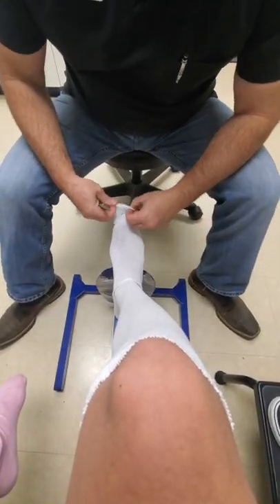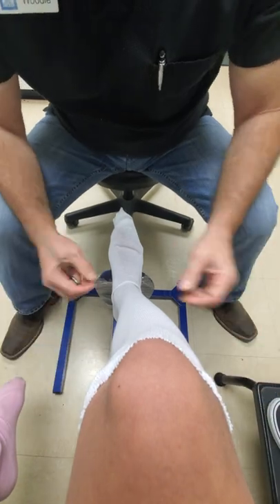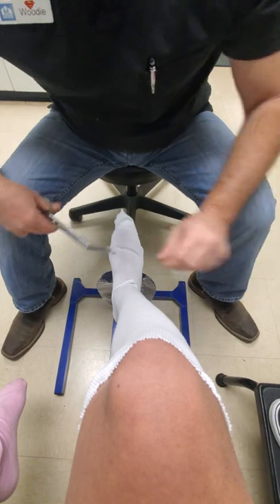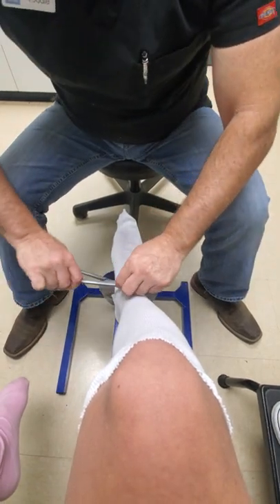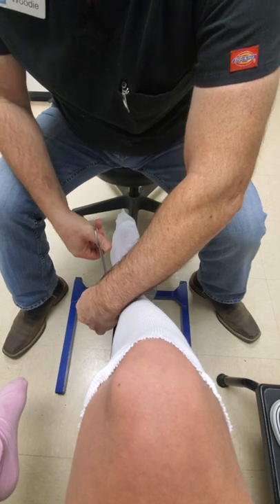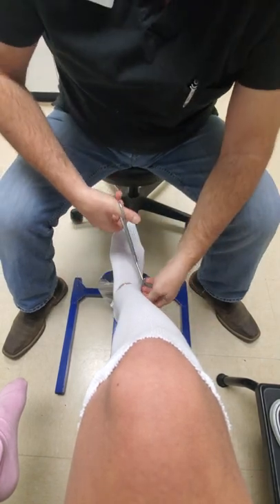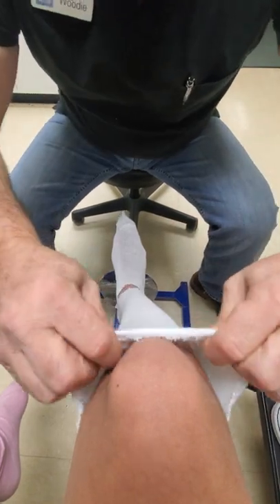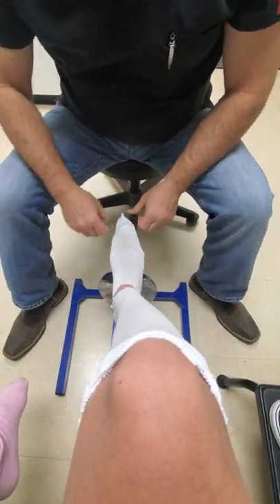We're going to start with your basic stockinette, which you've seen in multiple previous videos. I'm going to cut away to create that right angle as the doctor ordered, so that the stockinette isn't bunched up under the padding and creating any kind of marks or breaks in the skin.